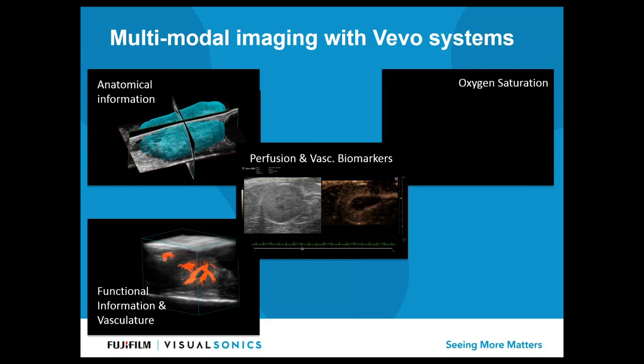Above and beyond ultrasound imaging, there's some other capabilities on the photoacoustic systems that we have, the Vevo LAZR and the Vevo LAZR-X.